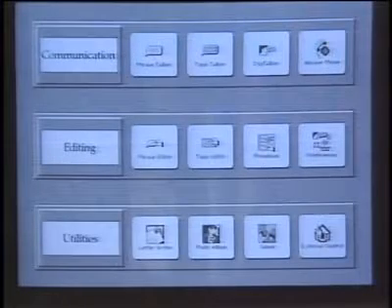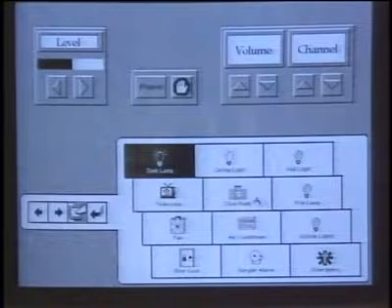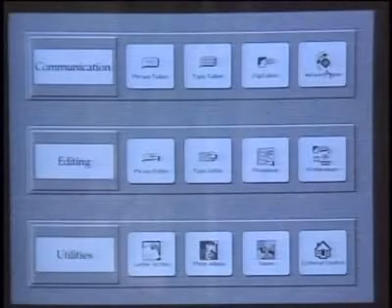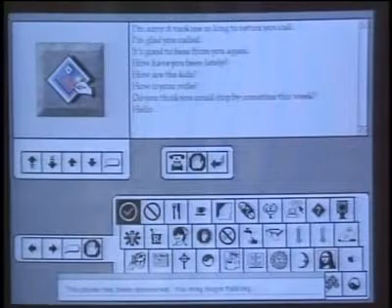Speechware is the first actual Prosthesiswear product. It runs under HyperCard and usually requires third-party hardware to enable a person with physical disabilities to use it. Some users have full control of hands or fingers, but others have only the use of one muscle.